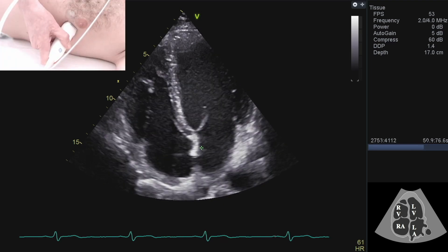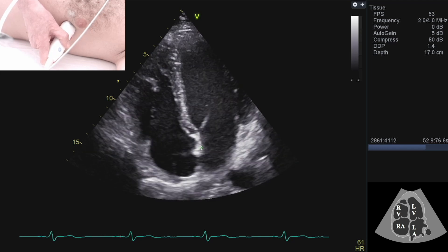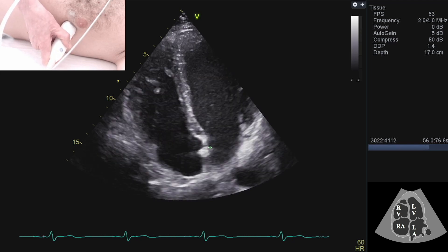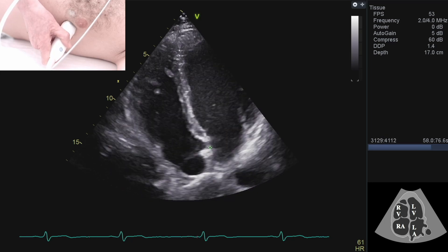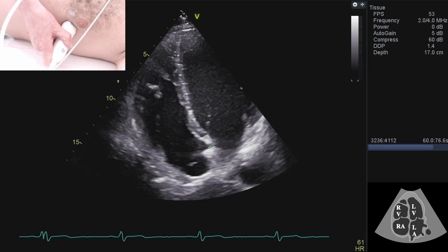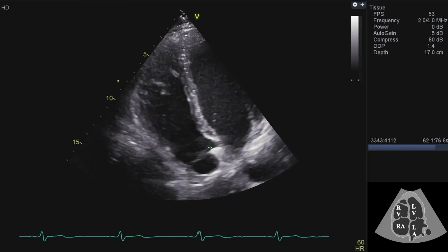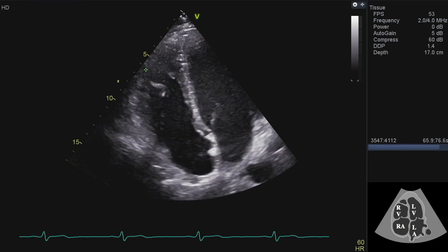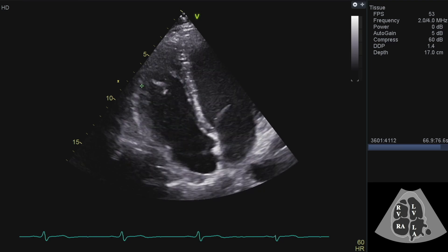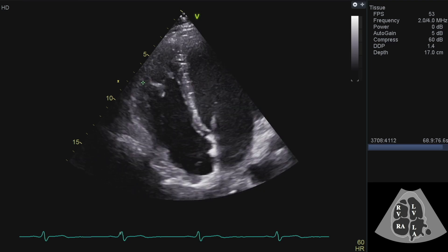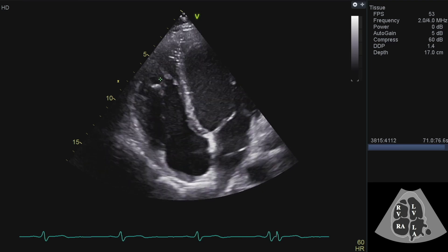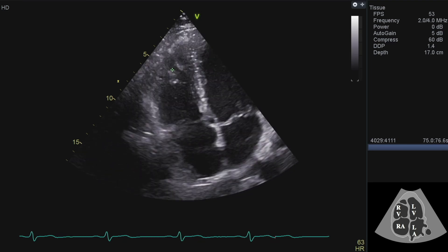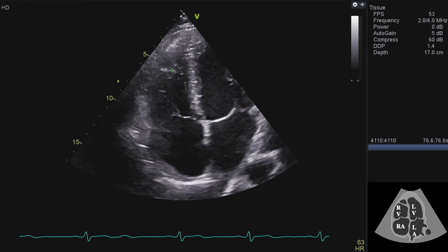If we move slightly to focus on the right ventricle — I've just moved my probe very slightly inwards, towards the spine — you can see how trabeculated it is. All these ins and outs of the right ventricle are free wall, and we can see there are cords going across the cavity of the ventricle. One of these is probably the moderator band.